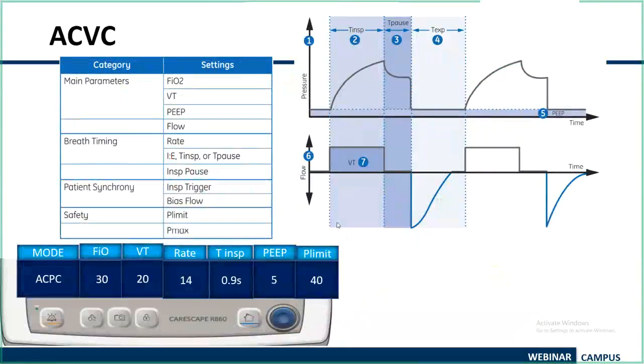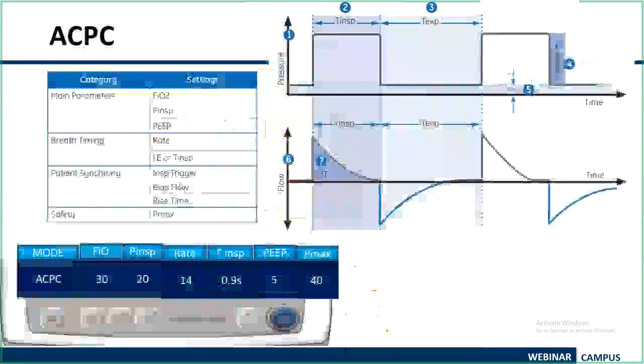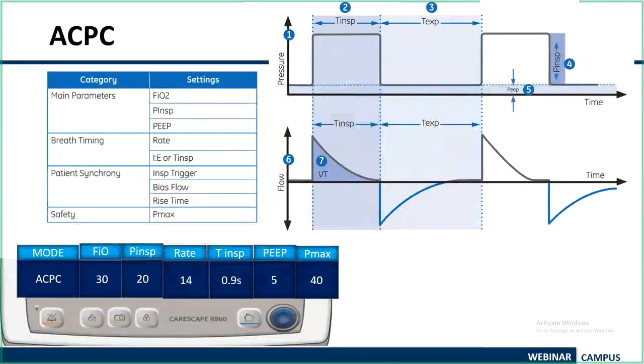So what are the parameters you will be setting here? Mainly the mode will be AC. Sorry, I'm sorry for this. This is actually AC/PC, the pressure control mode. I will come to that later.